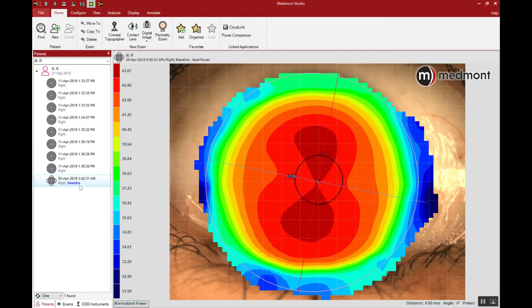It's also recommended to use the composite when building any kind of specialty contact lens. The composite gives us so much peripheral corneal information where the lens will land. Orthokeratology lenses are larger by design — 10.6 or 11 millimeters or even larger — so any large diameter specialty contact lens would really benefit from being built with a lot of peripheral data, not just central corneal information.